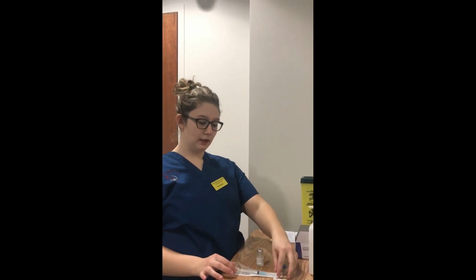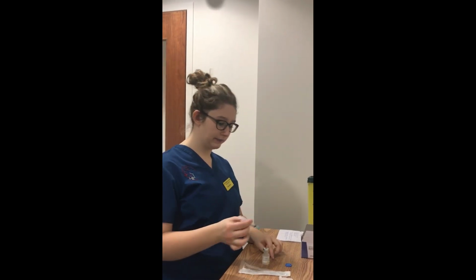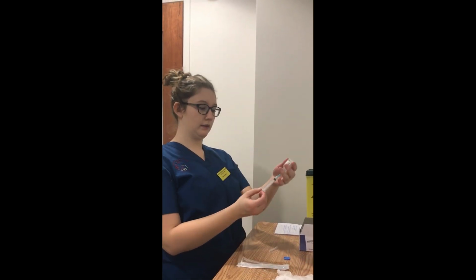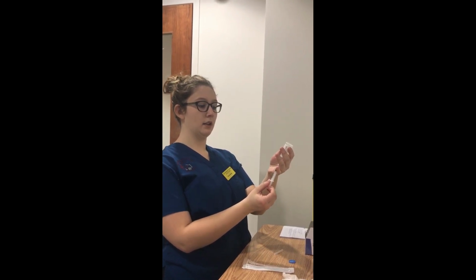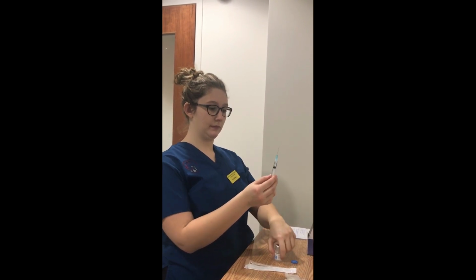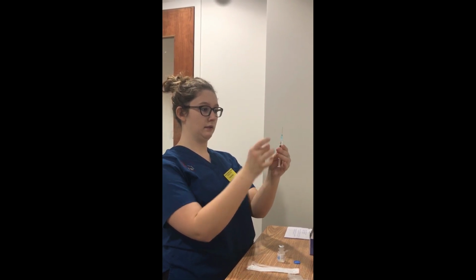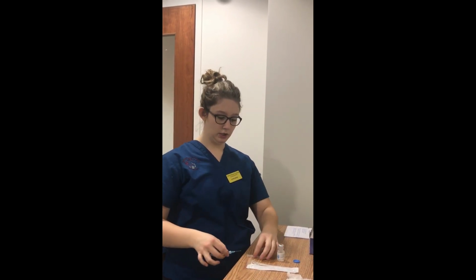Now I'm going to go ahead and draw up the heparin. So I'm going to remove the needle, take off the plastic safety, and then I will draw a little bit past the 1 ml line, just so if I do have air bubbles, I'll be able to get them out. And then now I will put the safety sheath back on.